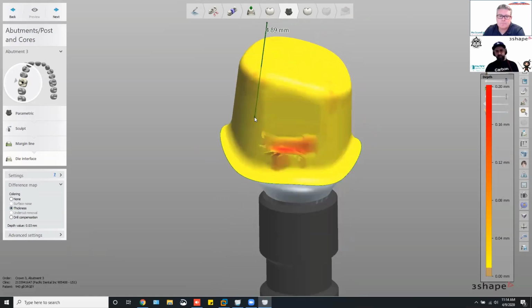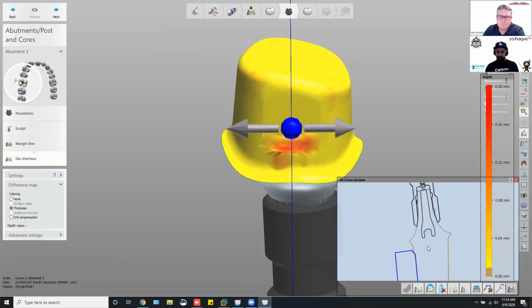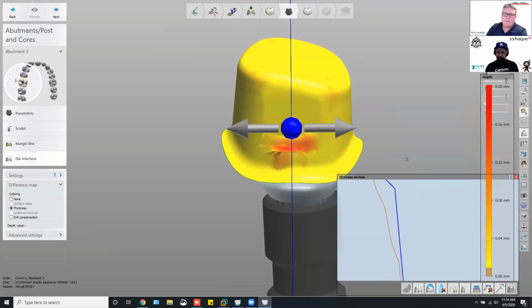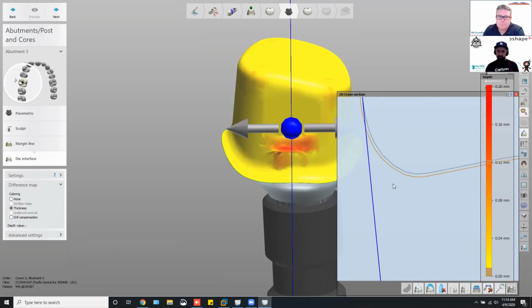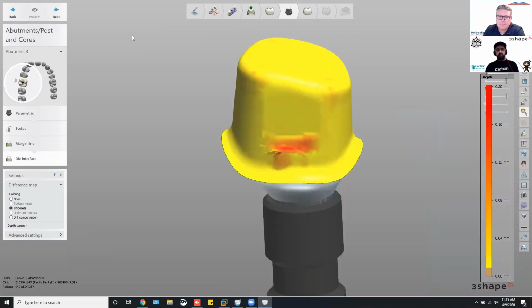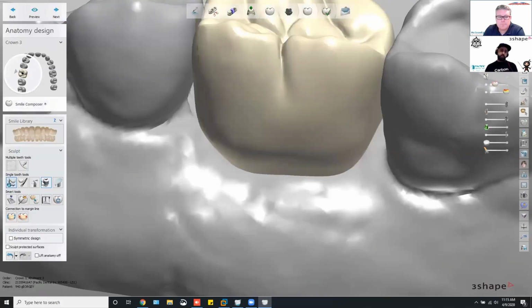It looks like it's messed up, but if we do a 2D cut real fast, we'll actually see that it's a lot more cleaned out. It cuts in here, but the drill compensation is out here, so I'm not too worried about this area. At the top, you see a nice contour. There's no drill compensation, it's all die spacer. So knowing how to do the proper design on the abutment for a split file is key, and that's where manufacturing comes in, even for regular crown and bridge, or when you do a big thimble bridge.